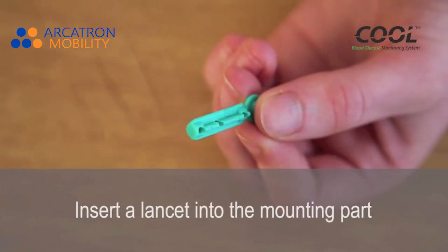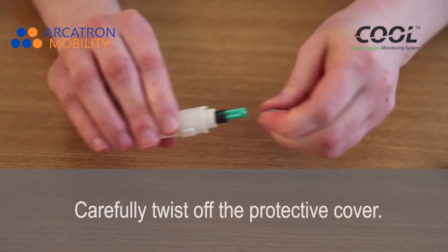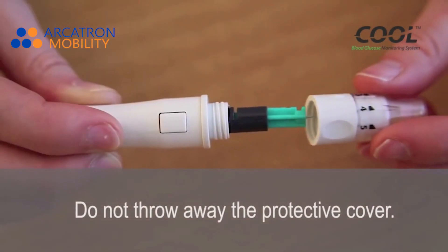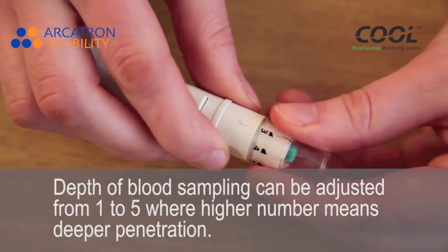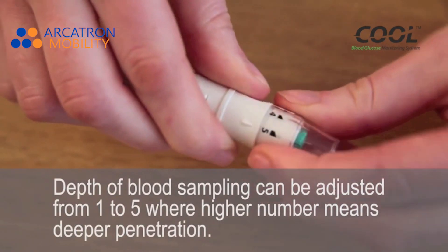Insert a lancet into the mounting part and push it all the way in. Carefully twist off the protective cover — do not throw away the protective cover. The depth of blood sampling can be adjusted from 1 to 5, where a higher number means deeper penetration.